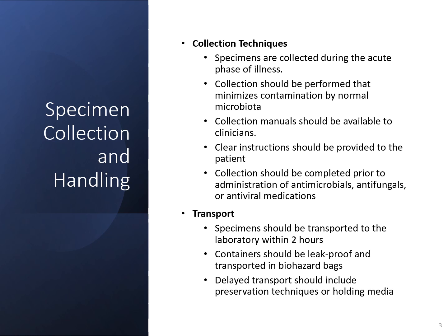Specimens should be transported to the lab usually within about 2 hours, just to make sure you can maintain the viability of that sample. However, if it is delayed, then there are different preservation techniques that can be used to help ensure that those organisms stay viable. The containers should also be leak proof, and they should be transported in a biohazard bag, because you never know what sort of pathogen is in the specimen. It could cross-contaminate something else, or it could leak out and be a hazard to those handling those bags. So you always want to make sure that you're avoiding any sort of contamination.